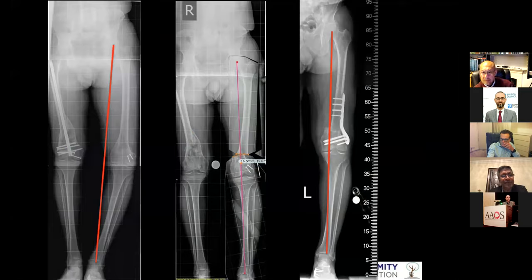Pictures, if you see, this is the preoperative picture. This was my initial planning, and here is the picture. And you have to say, this is slightly undercorrected according to the plan. This is because of the lack of translation; despite everything, I thought I had corrected, but haven't. Still, with this, there is a slight issue that can sometimes happen, but overall the mechanical axis here is within normal limits, although it's slightly undercorrected.